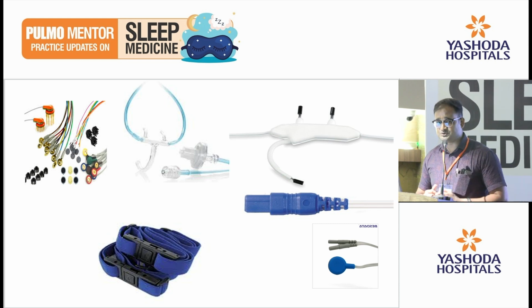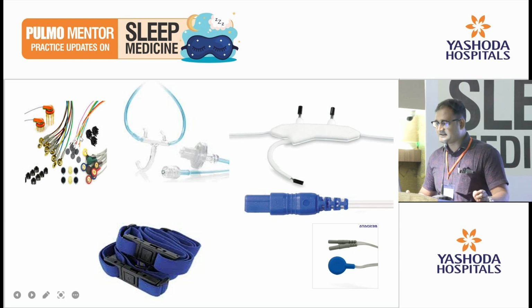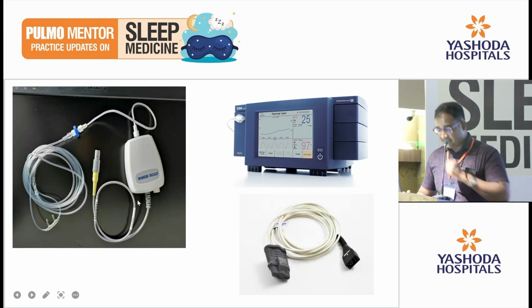Then next comes the channels and parameters used in polysomnography, so that your subsequent lectures will be easier for you. So these are the things we use in polysomnography. These are the EEG and ECG leads, nasal cannula, nasal thermistor. These are abdominal and thoracic belts. This is the snoring channel. This is EtCO2, end-tidal carbon dioxide, transcutaneous CO2, and pulse oximeter.